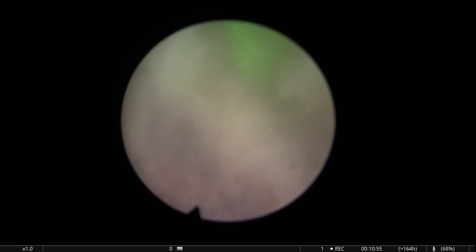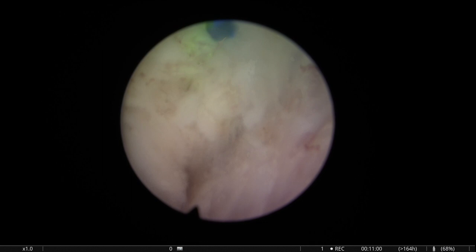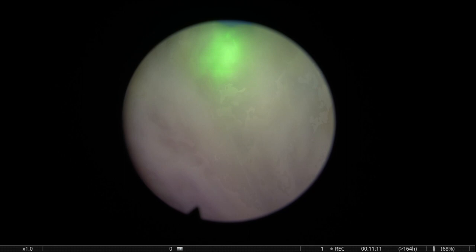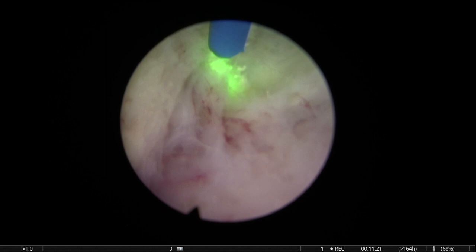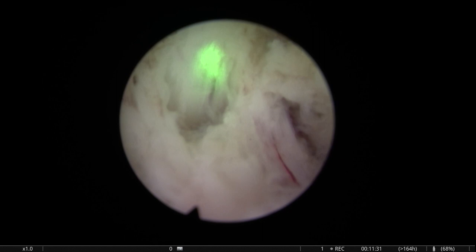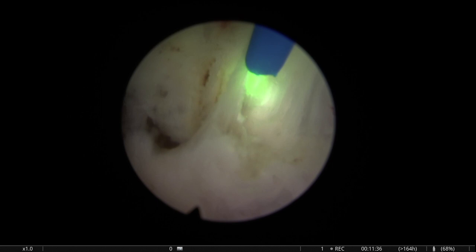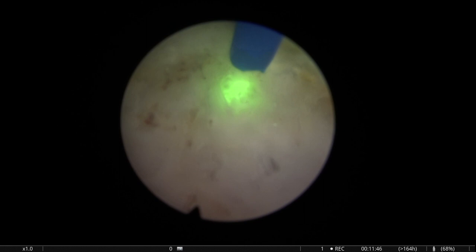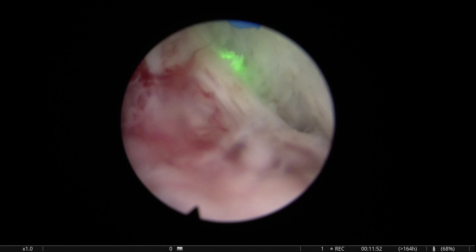So here you can see how I'm challenging the plane all the time. We had an original plane, but I see that there is yellow tissue. So I'm not afraid to probe, I'm not afraid to explore, because sometimes you have something that looks like a good plane or a reasonable plane, but then you find that you can go even further to look for the real plane. So you shouldn't be afraid to try. If you're careful and you're getting in the capsule, you're going to realize that you're going in the capsule, and you will be able to stop before you go too deep. So you have to be, as I said, careful, advance in terms of millimeters rather than having to do very deep cuts, just slowly, carefully, try to probe and see and challenge.